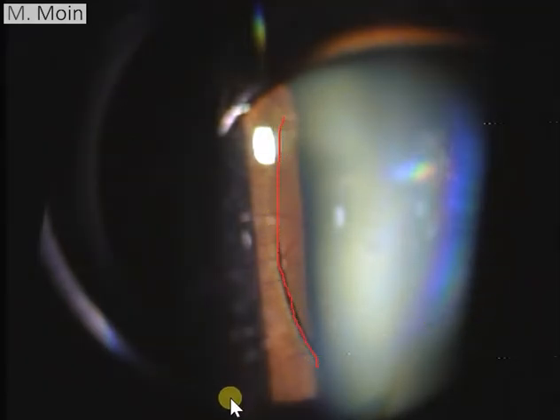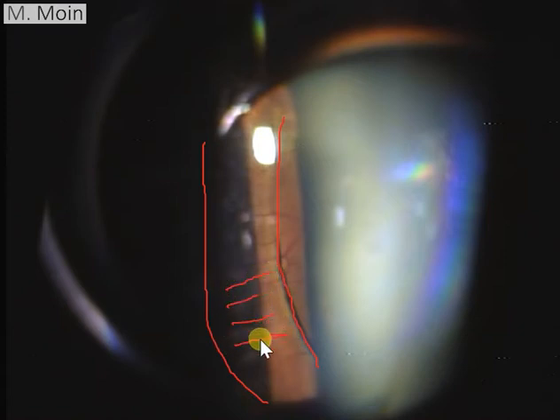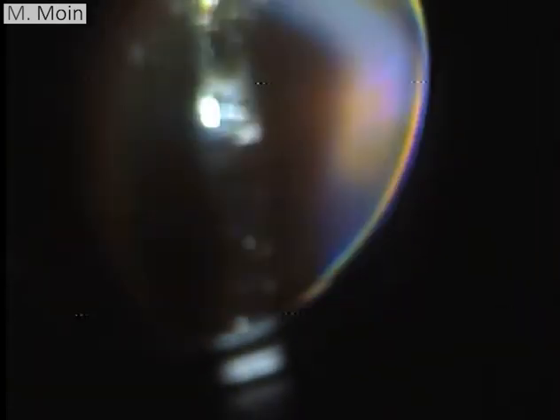If the buckle is too tight, you will get radial folds on the buckle like this. So there are no radial folds on the buckle. So the buckle height is adequate, and some people might say it's a moderate amount of buckle height. If you give too much height, then you will get these radial folds. And if you get too much buckle height, then sometimes the eye will become myopic because of the high buckle, and sometimes it will compress on the vortex vein and it can produce anterior segment ischemia as well.